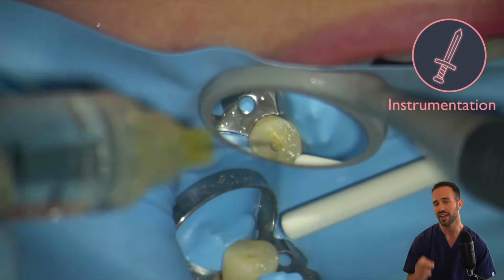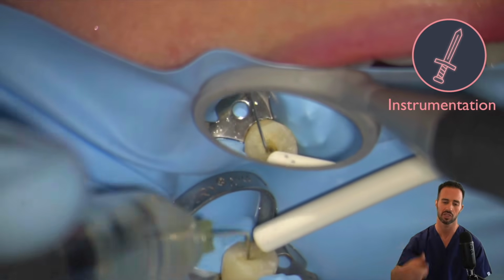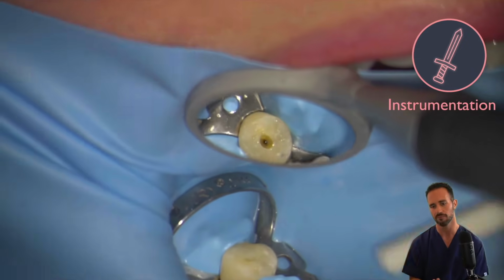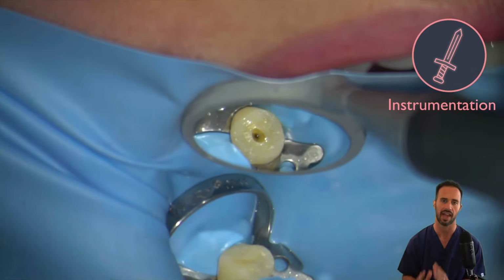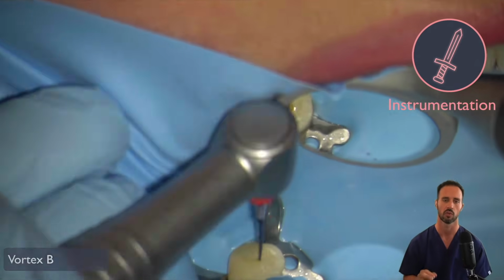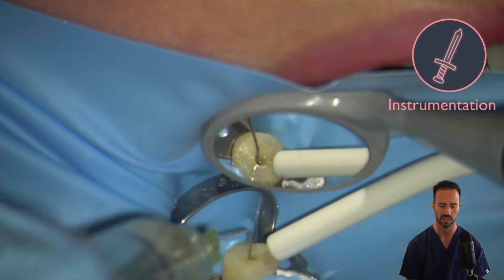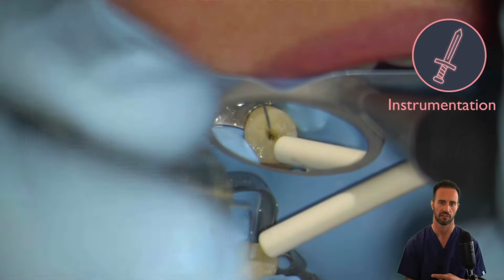And remember, between every single rotary file, we want to use a lot of sodium hypochlorite, again in a 50-50 dilution, to try to minimize any chances of a sodium hypochlorite accident. So now we're moving on to our size 20/04 Vortex Blue rotary file, and taking that all the way to 23 millimeters, and again rinsing with our sodium hypochlorite between the files.